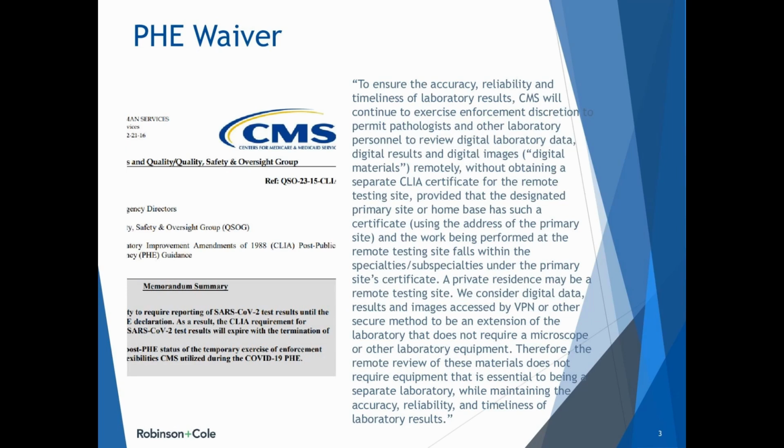And then you also have to think about any state regulations. For example, New York heavily regulates laboratories and pathologists, and they did determine that the use of digital imaging slides doesn't require a separate submission as a laboratory developed test, which is important, particularly with the new LDT rule and being in New York. And they even went so far as to say this includes digital imaging of slides with subsequent use of artificial intelligence and machine learning. So that's important to keep in mind.